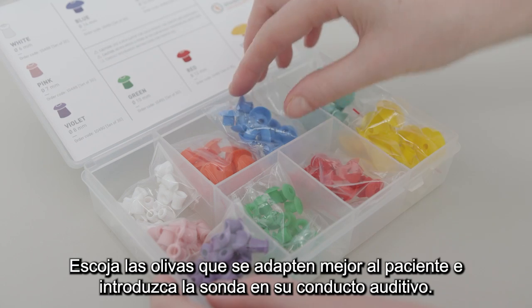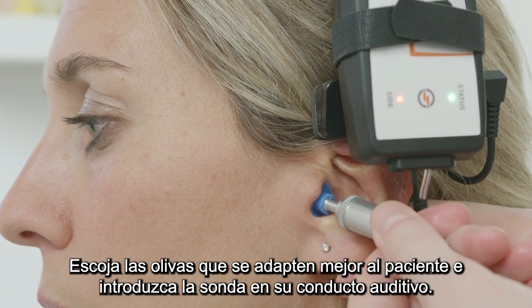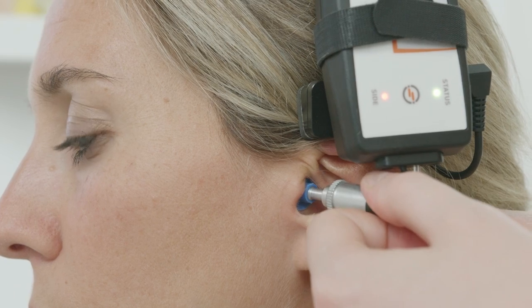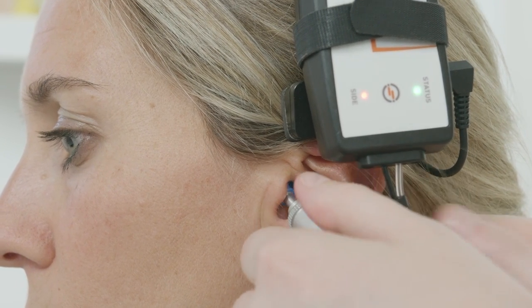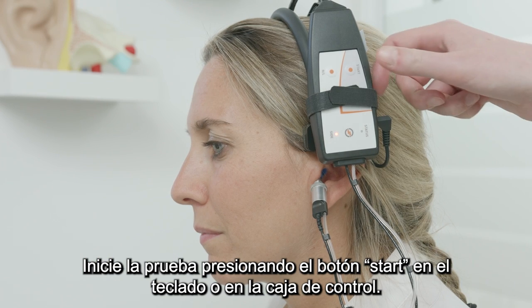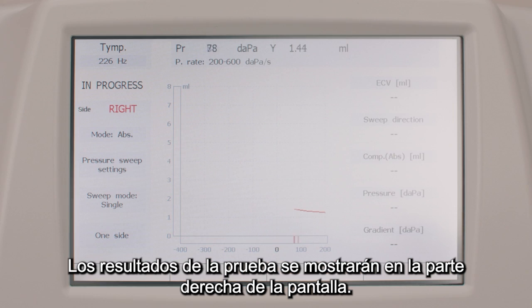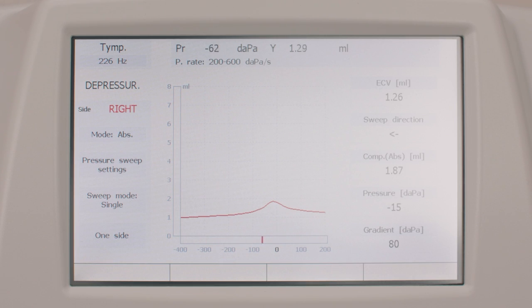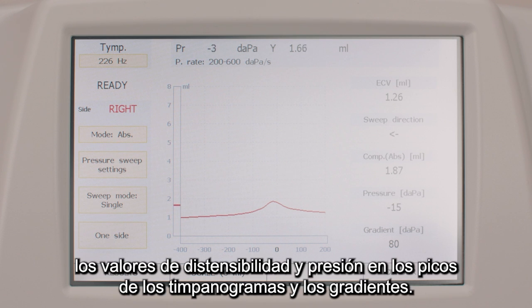Select the ear tips that best suit the patient and introduce the probe into the patient's ear canal. Start the exam by simply pressing the Start button on the keyboard or on the control box. The results of the examination will be shown on the right-hand side of the screen. Here you can find the ear canal volume, the compliance and pressure values at the peak of the tympanograms, and the gradients.